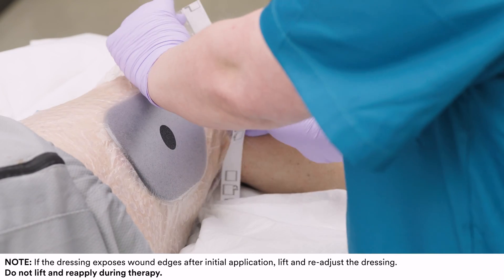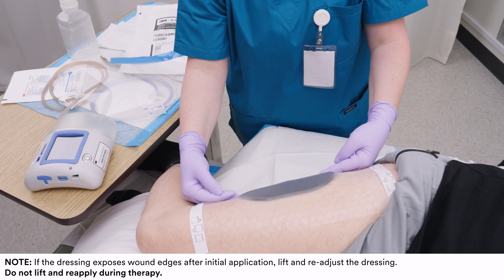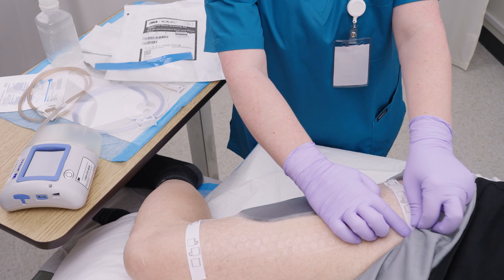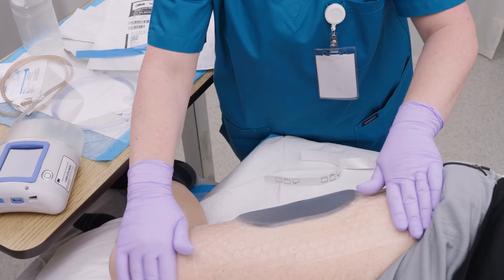Assess the dressing placement. The dressing can be repositioned upon initial placement. Smooth any wrinkles or creases. Press down on the border of the drape to ensure a good seal. Remove the handling bars and pat down to establish an occlusive seal.